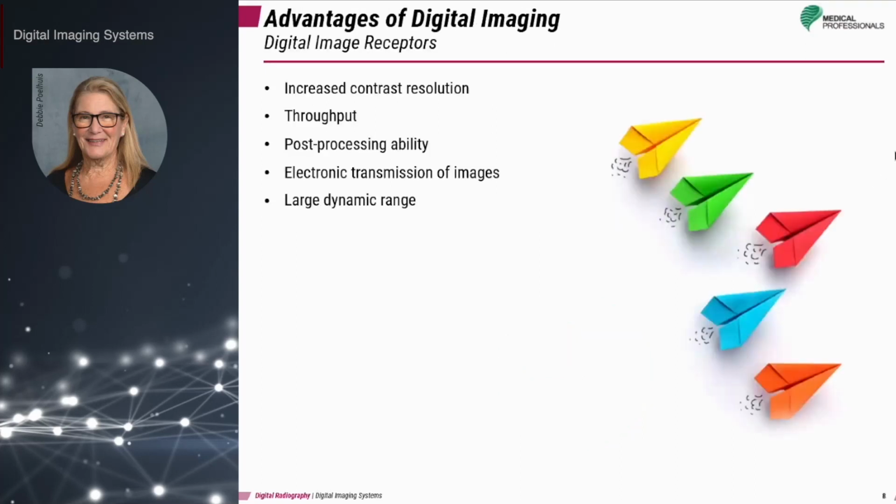Again, some advantages of digital imaging. Several advantages over film screen imaging. For example, it provides increased contrast resolution, which really means more shades of gray are available based on the pixel bit depth of the system.